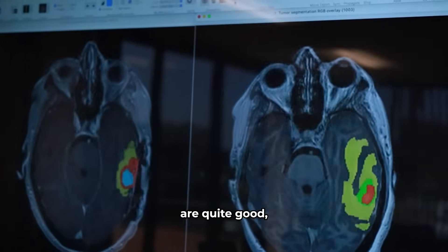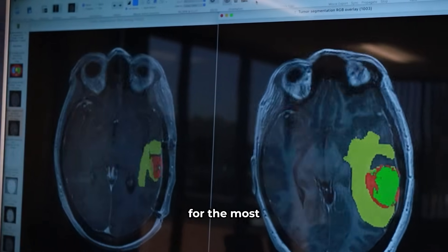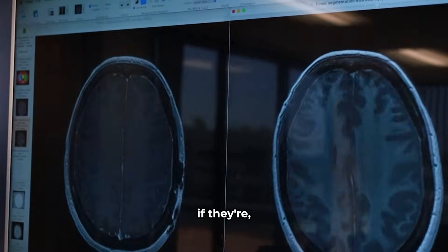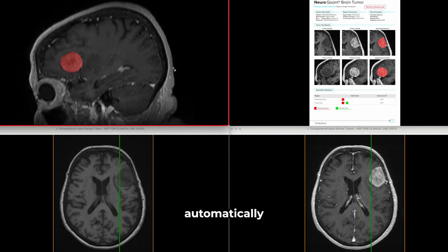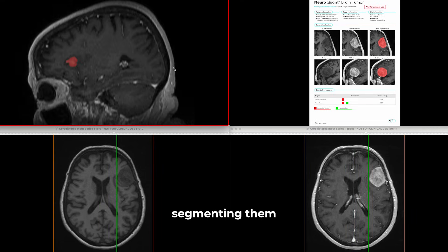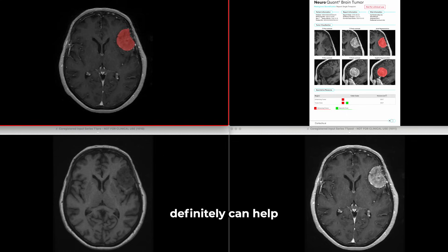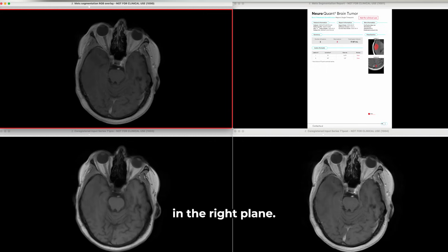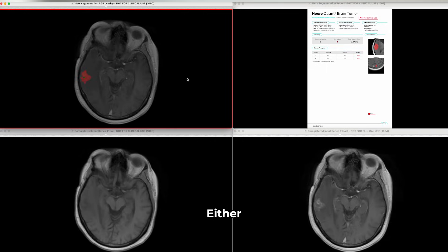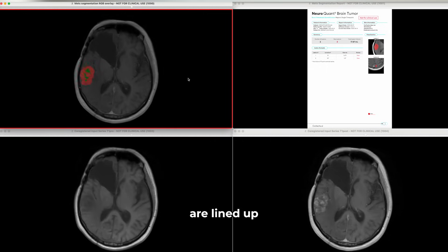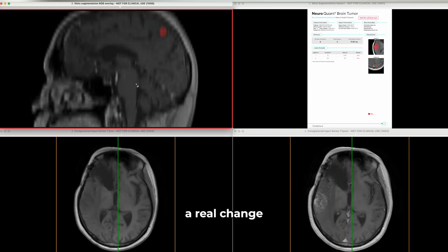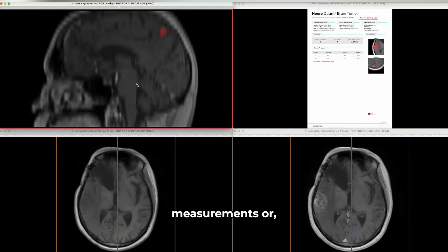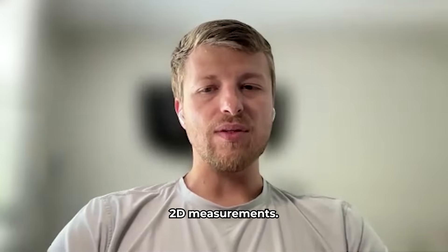Automated segmentation approaches are quite good for the most part, especially for lesions greater than five millimeters. By automatically segmenting them and tracking them across time, it definitely can help your workflow. You don't have to line up every image in the right plane — you can look at the segmentation, see that the lesions are lined up, and then quantitatively determine if there's a real change, rather than relying on subjective or imprecise 2D measurements.